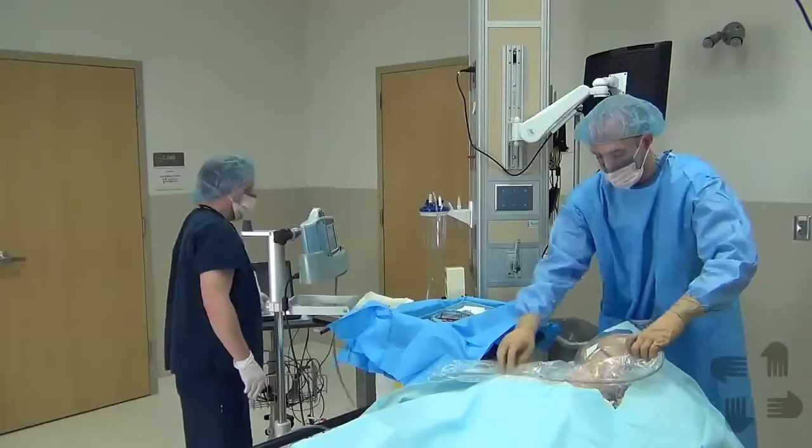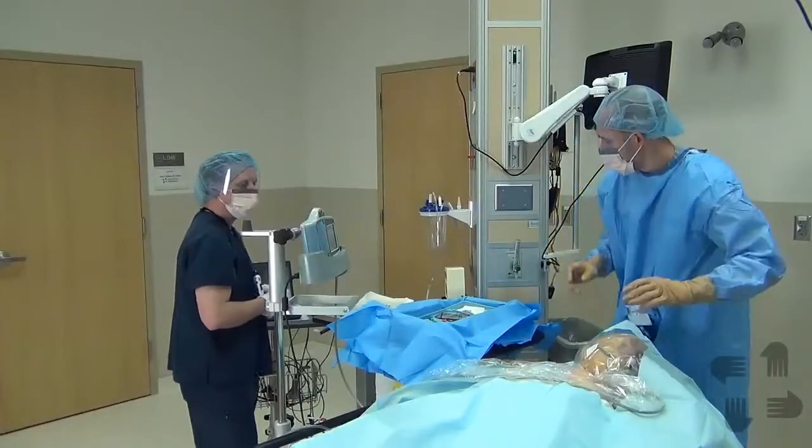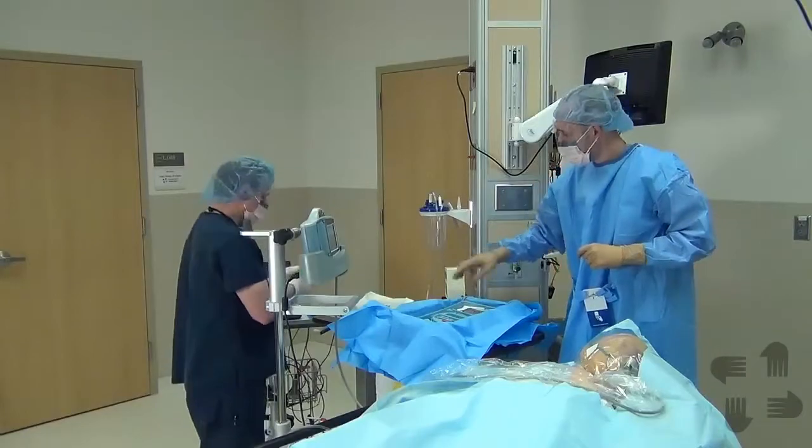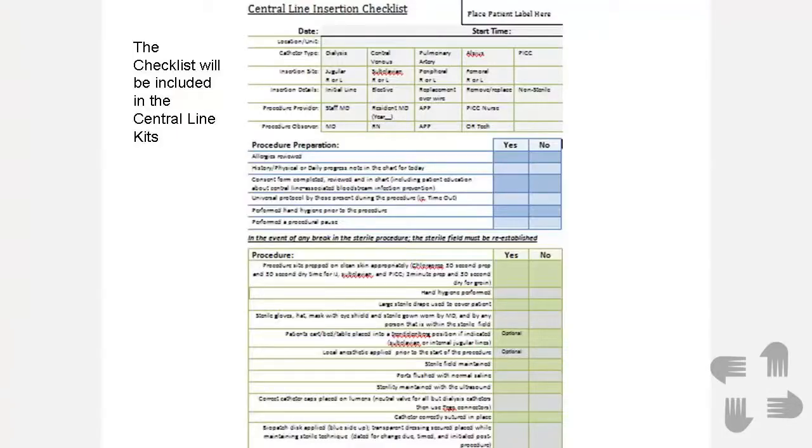Okay, thanks. You bet. Where would you like the flushes? I'll take 2 flushes in this well here, and I'd like you to hang on to the other 3.